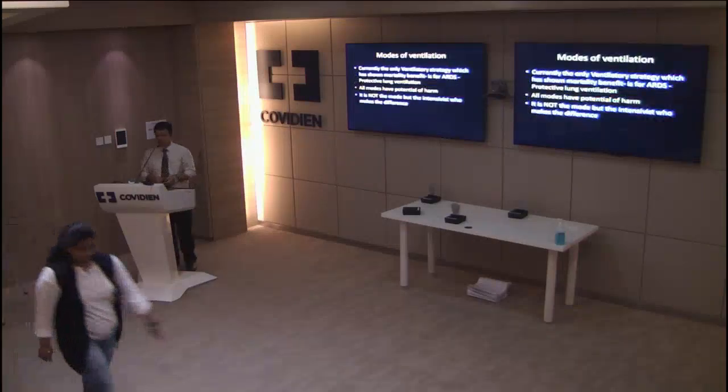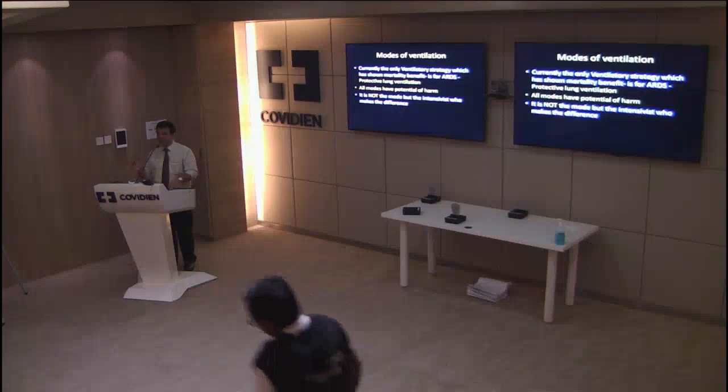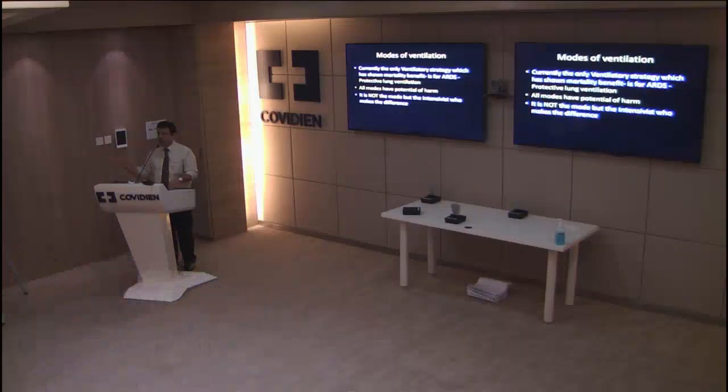Currently, the only ventilatory strategy which has been shown to improve mortality is protective lung ventilation in ARDS. It is rather a problem that protective lung ventilation has crept into our day-to-day practice in such a way that even if the patient doesn't have ARDS, just a normal ventilated patient, just a patient who has come post-operatively, there is an immediate reaction from people that let's just give a very low tidal volume ventilation.